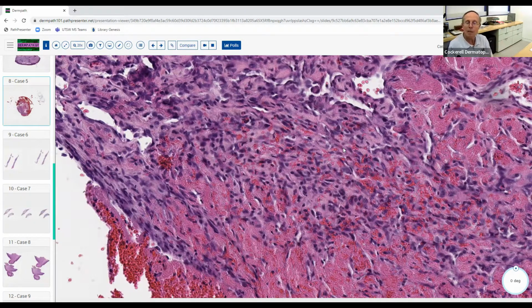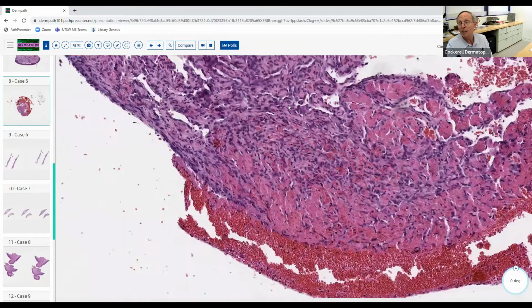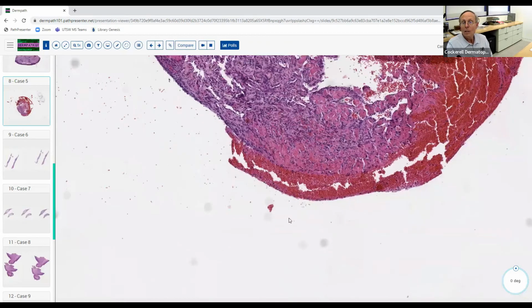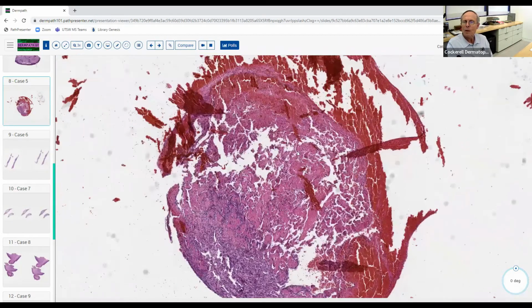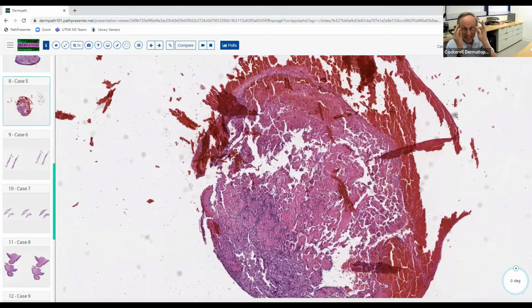It's just basically a manifestation of a traumatized blood vessel that gets thrombosed, recanalizes, organizes, and then sometimes forms pyogenic granuloma-like changes in it. You guys have probably seen this, right? I mean, this isn't just commonly seen in dermatopathology. It's probably seen pretty commonly in the kind of stuff you see at your gross tables and things like that, right?